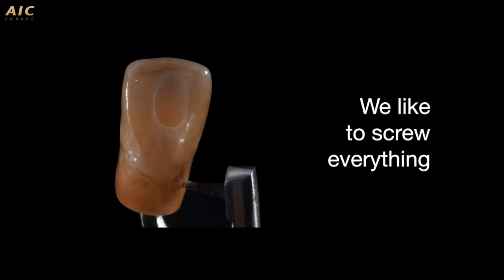Above all, we don't use cement to retain our crown on the implant.